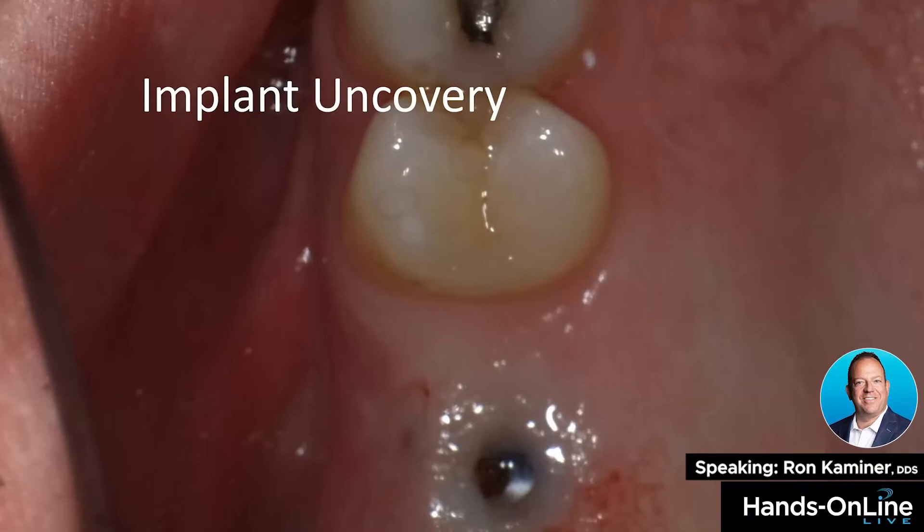Diode lasers are indispensable when uncovering implants because they're not absorbed by metal. You can literally touch the healing screw, the healing abutment, or any abutment and you won't have any damage.